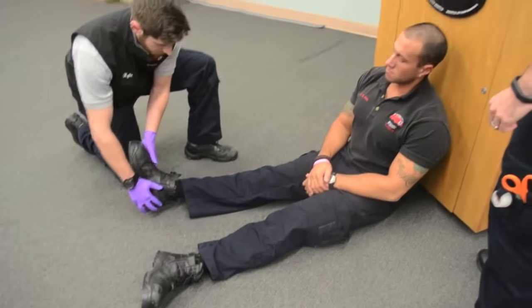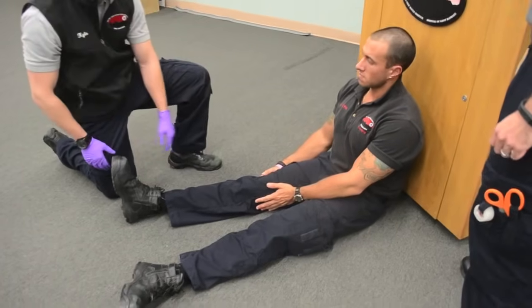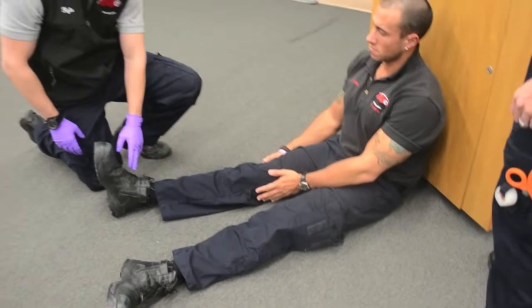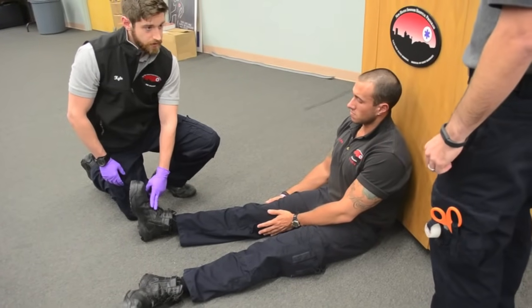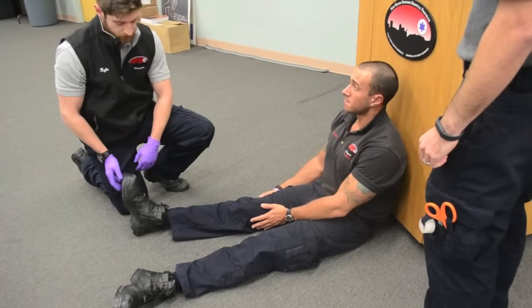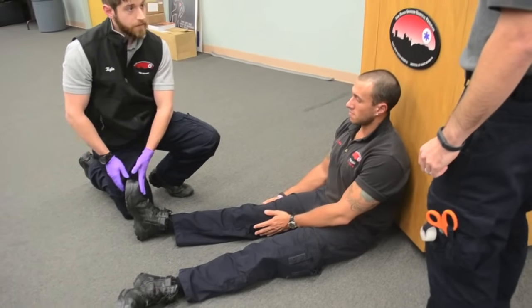Correct. Sir, can you just sort of help hold your leg in place for manual stabilization. I am going to assess PMS on the injured extremity. Checking pulse - pedal pulse is present. Sir, can you feel this? I can. And can you push down on my hands? And push up on my hands. PMS is intact.